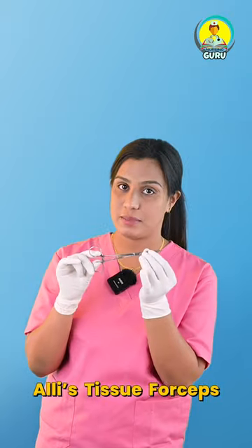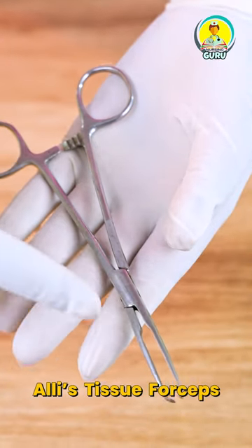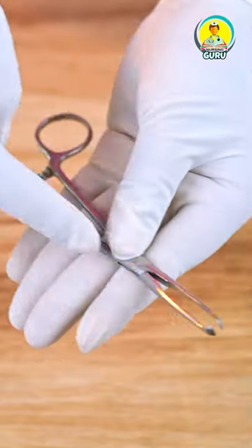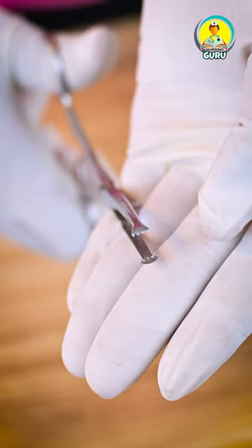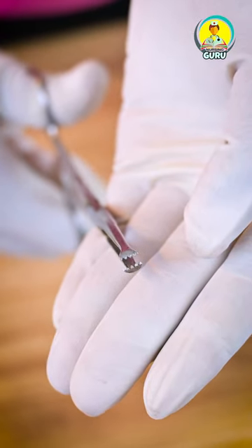Hi, can you remember this instrument name? This is known as Allis Tissue Forceps. Allis Tissue Forceps are used for grasping organs and slippery or dense tissues during electrosurgery. It is a straight forceps with a lock, and it has sharp teeth used to hold heavy tissues.